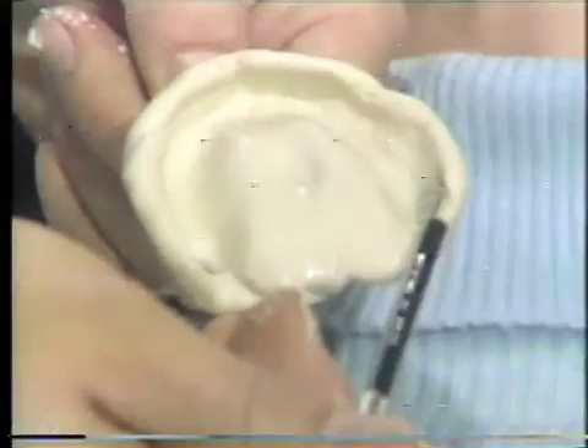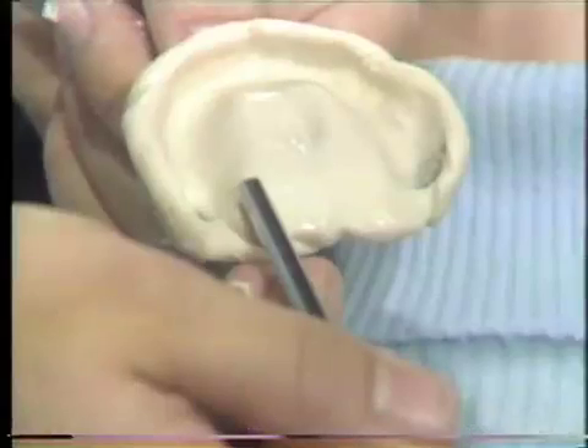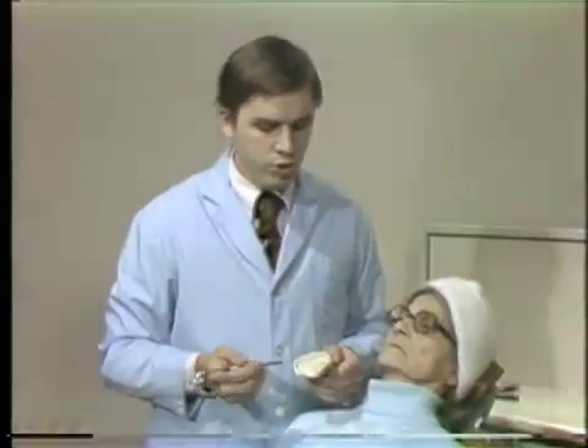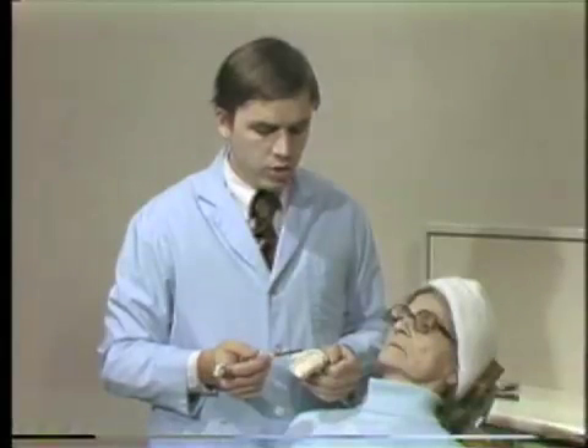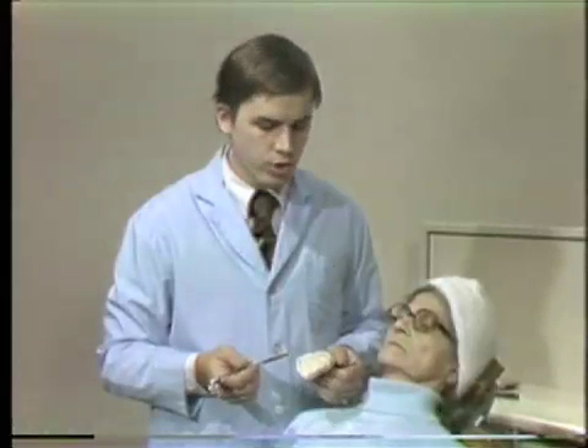Here is the hamular notch. Across the back is the junction of the hard and soft palate. This impression should duplicate in negative the anatomy that you would find in the intraoral situation.